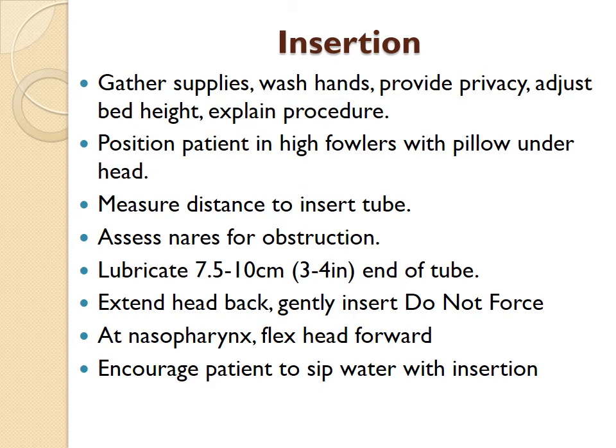So after you've measured the distance to insert the tube and you have now flagged the tube, now remember this is a clean procedure. You're going to put that incontinence cloth or the towel out on the patient so that you can basically use it as your little area to work with. Again, if I didn't mention it before, and I apologize, I'm going to remind you, make sure you bring a basin.